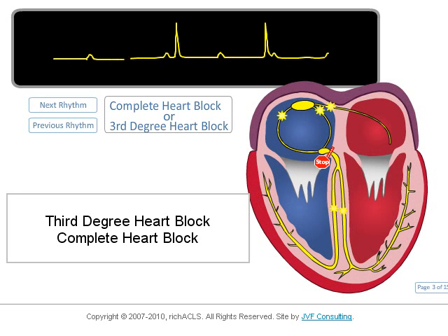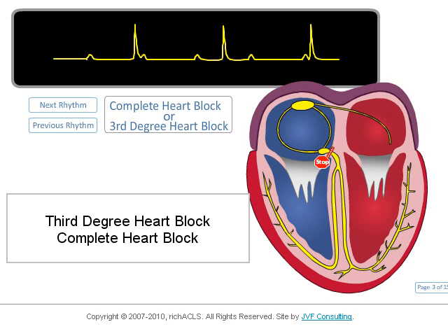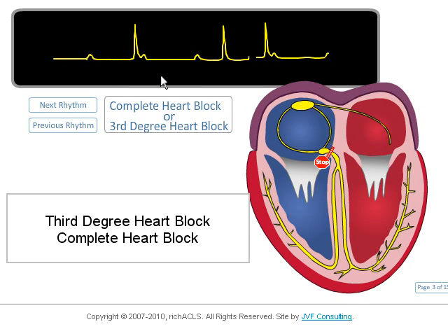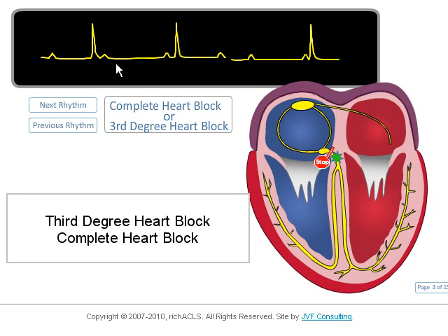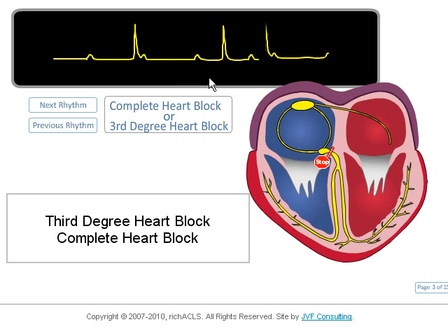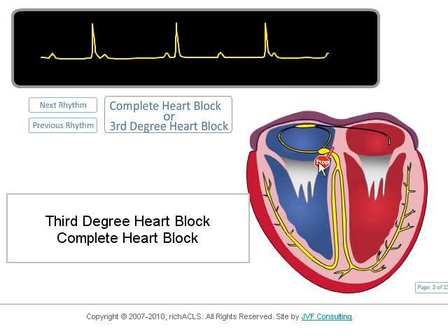Here is third-degree heart block, also called complete heart block. The unique characteristic of this rhythm is the dissociation of atrial and ventricular conduction — there is no PR interval. The atrium is firing at a different rate than the ventricles. The atrial rate here is about 60 and the ventricular rate is about 30. The AV node is damaged and cannot conduct impulses from the atrium to the ventricles.